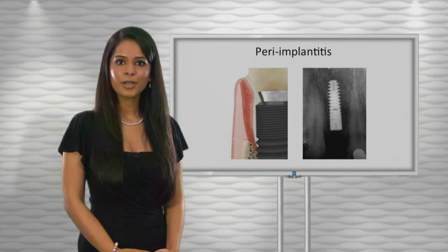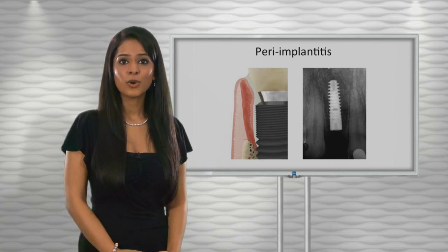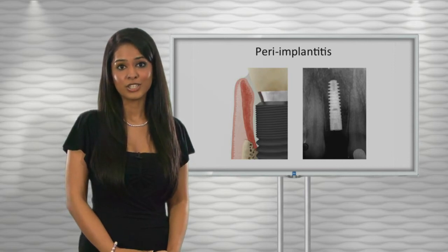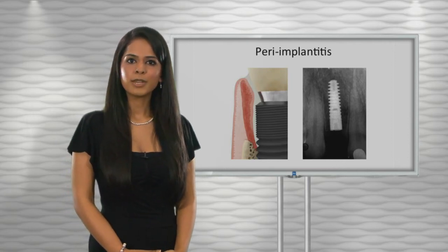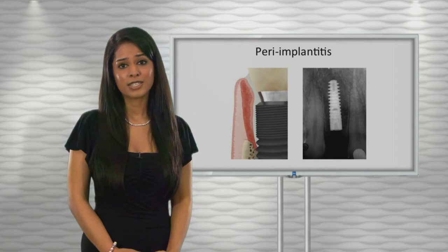Comprehensive treatment of peri-implant disease remains an enigma, but is largely dependent on the underlying etiology at play. The first phase of treatment usually involves the control of acute infection and the reduction of inflammation. This involves the removal of plaque deposits and improved patient compliance with oral hygiene. Many further treatment lines have been suggested. As more and more implants are being placed by clinicians of varying skill levels and clinical backgrounds, the number of patients presenting with this disease appears to be on the rise.